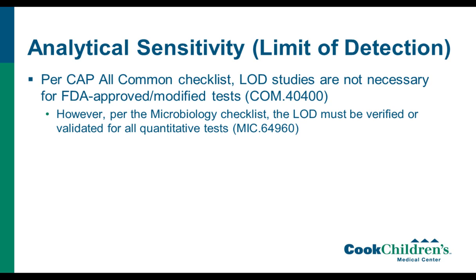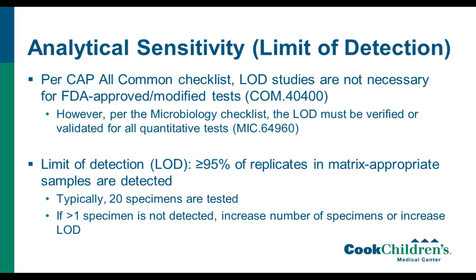Another requirement for validation verification is analytical sensitivity or limit of detection. Per the All Common checklist, LOD studies aren't necessary for FDA-approved or modified tests. I'm sorry, that's a typo. That should be FDA-approved or cleared tests. But per the microbiology checklist, the LOD must be verified or validated for all quantitative tests. So even though we got away with it in the All Common, the microbiology checklist says that we have to do it.